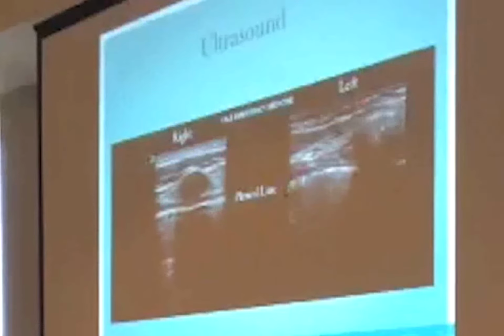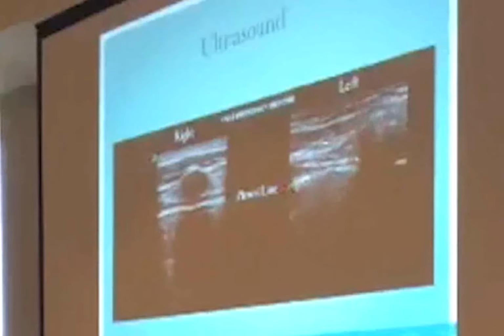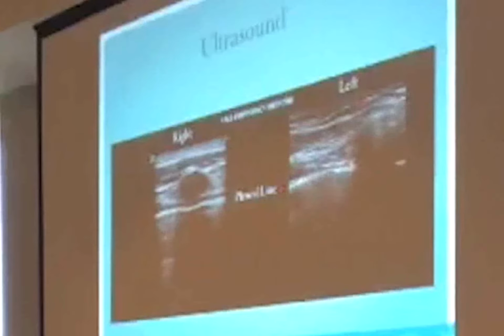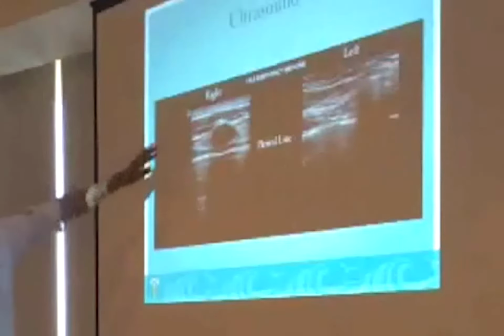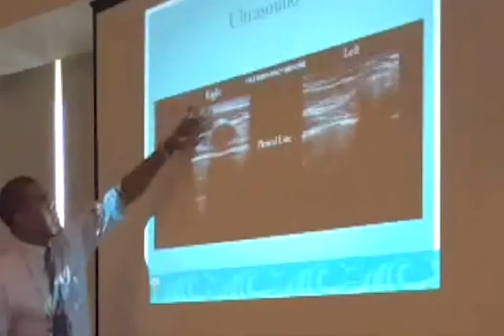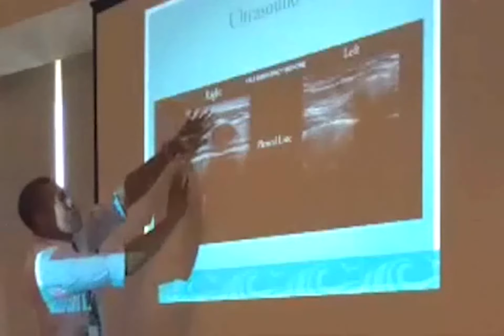Over here, it can kind of get tricky. You do see this shimmering line here. You do see this white line, but you don't see any coordinated movement below the line, independent of the top. Up here, all the tissues at the top are completely still, and the tissues at the bottom are moving.